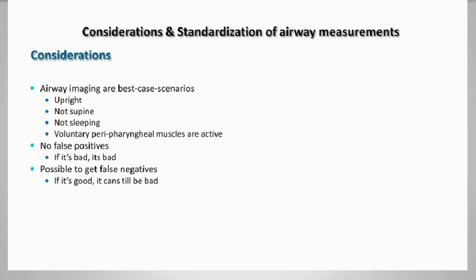So imaging protocol is very important. Standardization of how we scan patients must be considered. So what we've done in our office is develop kind of strict protocols. First thing we do is we put the patient in centric relation. We want to have a seated condyle the best that we can. So if a patient is posturing forward into, say, an underbite, that's going to give us an erroneous representation of the airway. So we try to control for jaw position.